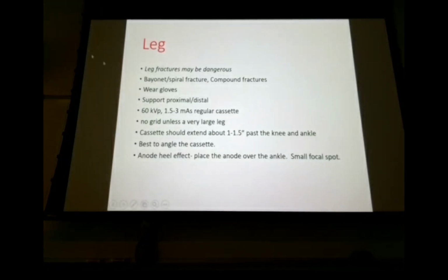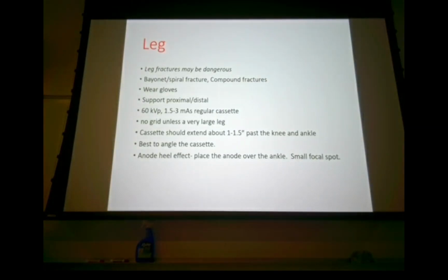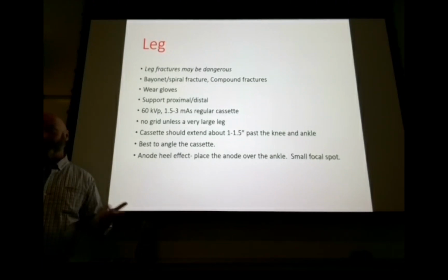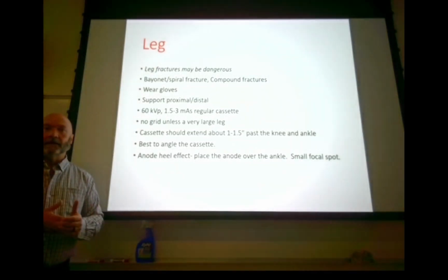All right, so leg fractures. First off, once we get to these large, long anatomies, be aware that the patient could have a compound fracture. They could have been bleeding. I recommend you wear gloves with feet. Feet are nasty, right? And you don't know what's going on with the patient.